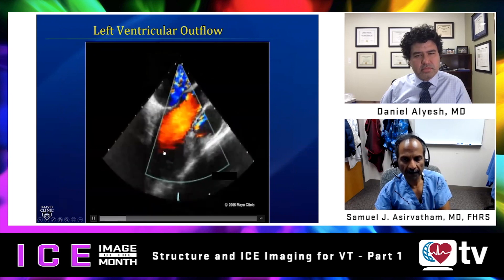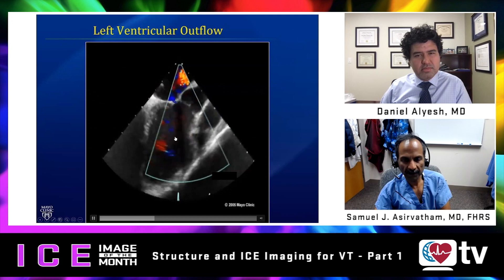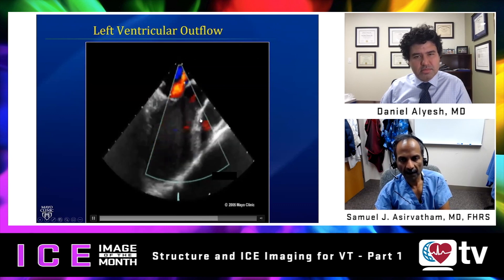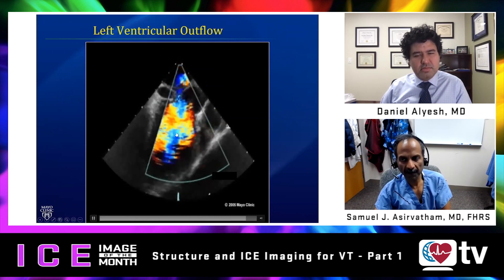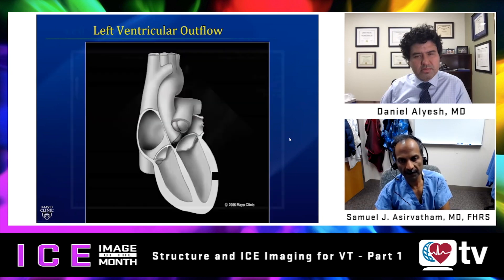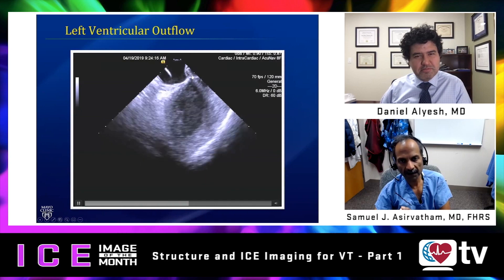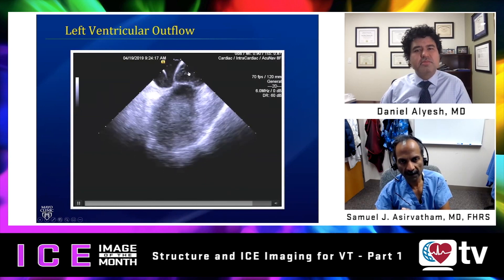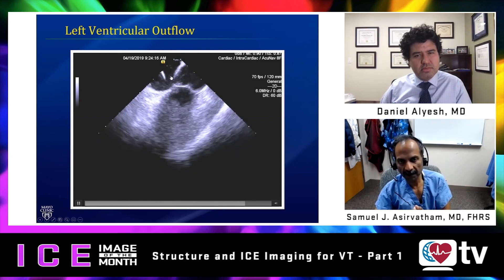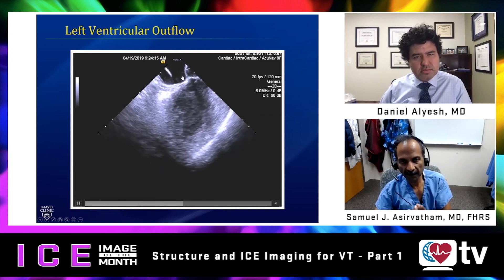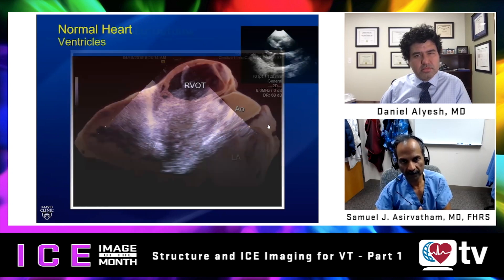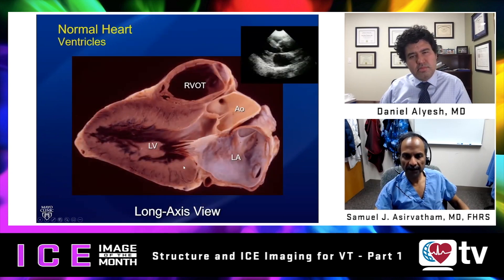To transition to a better idea of the left ventricular outflow is a very small move where we lose the RV inflow but still see the relationship between the aorta and the right ventricular outflow tract, opening up the left ventricular inflow for visualization, contact mapping, and ablation at common sites — for example, in sarcoid ventricular tachycardia. This is an excellent view when mapping above the sinus of Valsalva. Contact force may tell you you're making contact, but that could be at a site of little myocardium, excess pressure against the valve, or inadvertent cannulation of a coronary vessel. That differential diagnosis is easily resolved with intracardiac echo.